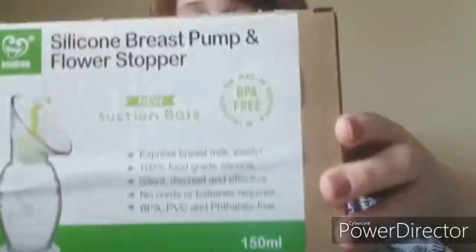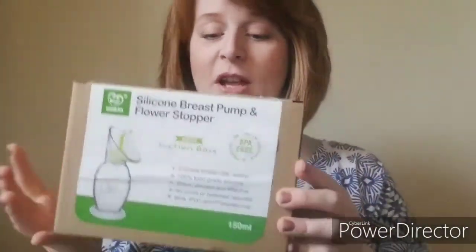It expresses breast milk easily, 100% food-grade silicone — win, win, win. Silent, discreet, and effective — win, win, win. No cords or batteries required. BPA, PVC, and phthalate-free. This is a really simple, simple little option.